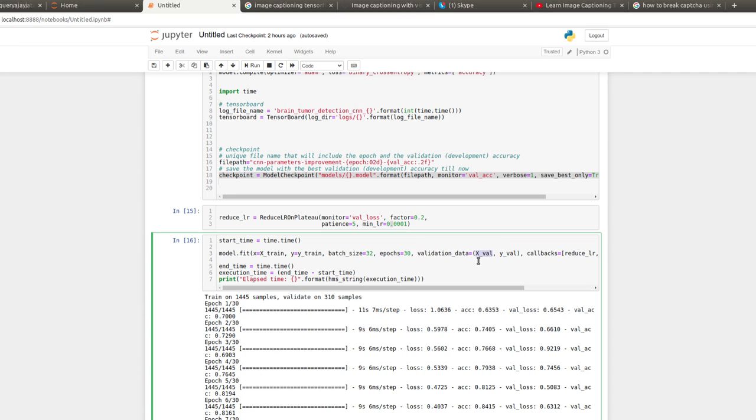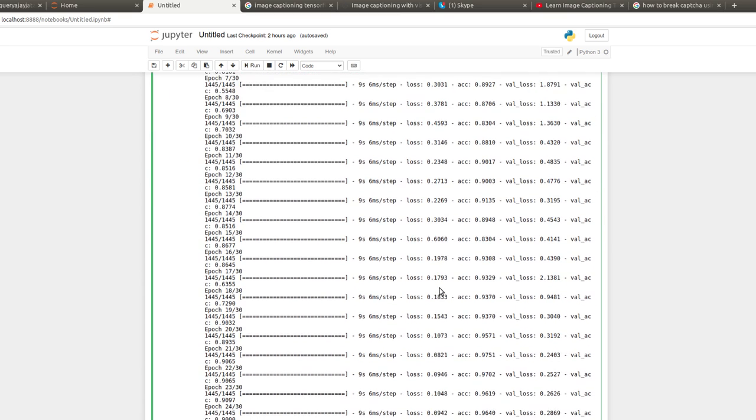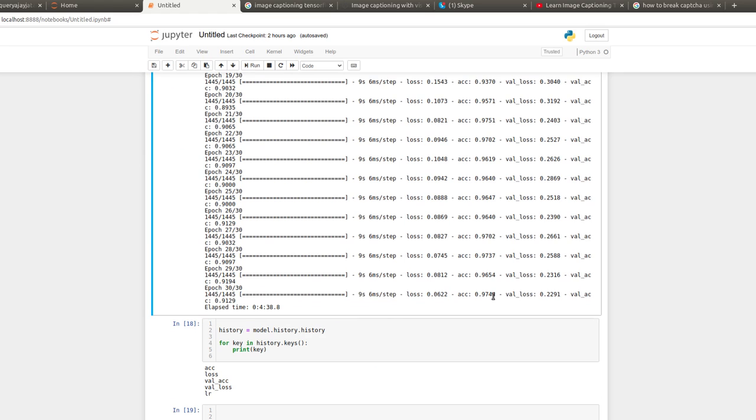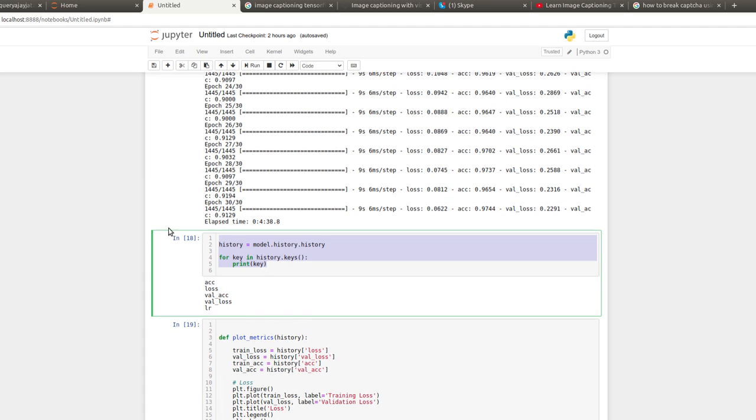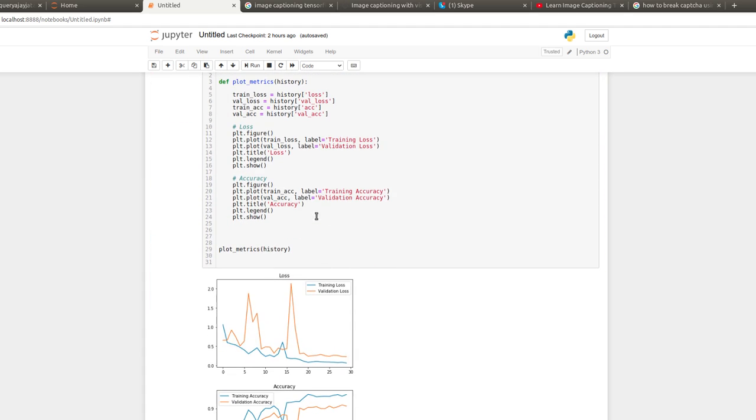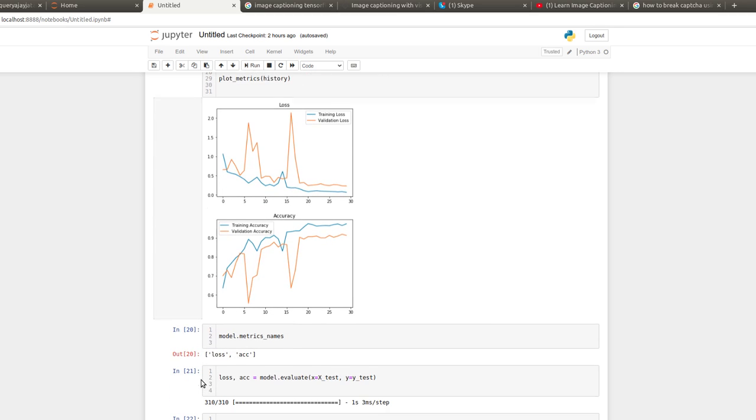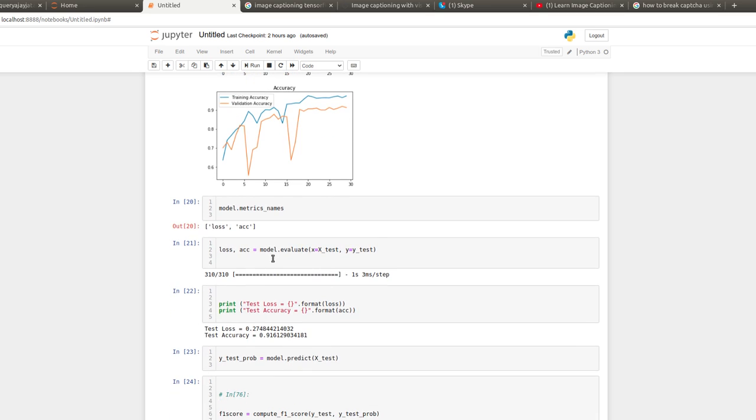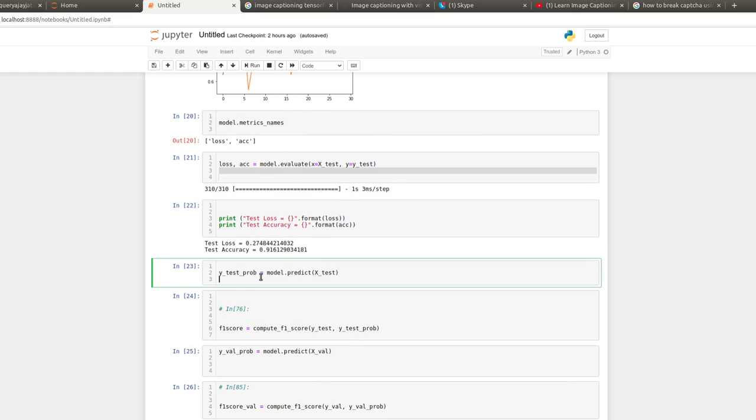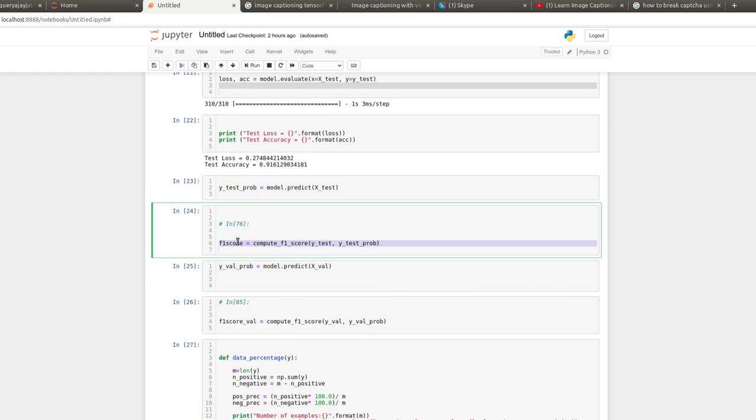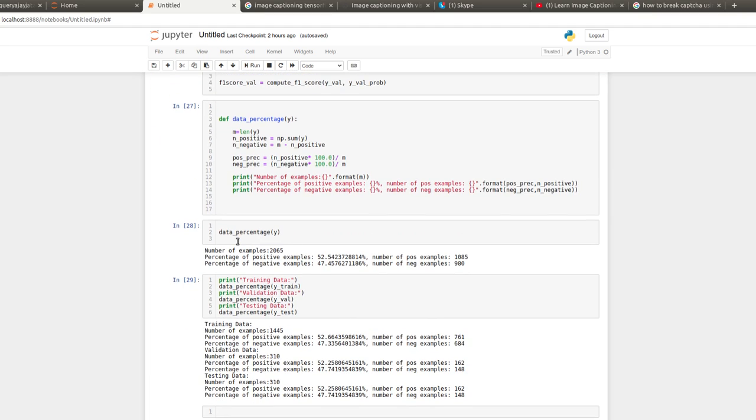Once the training is complete, you can see we have training accuracy of 97% and validation accuracy of 91%. In model history, you can see how the training is converging and how the validation accuracy is being performed. After evaluation of the model, you can see the test loss and validation loss. We have also computed the F1 score, and finally our model is ready for deployment.